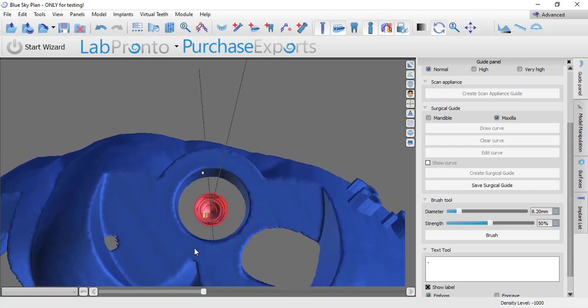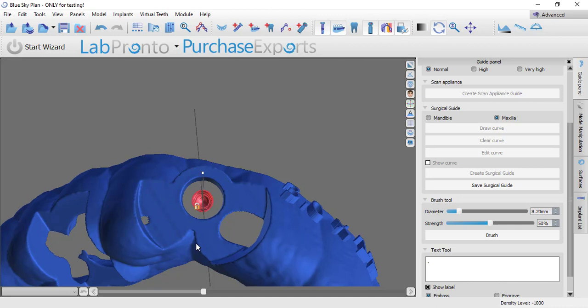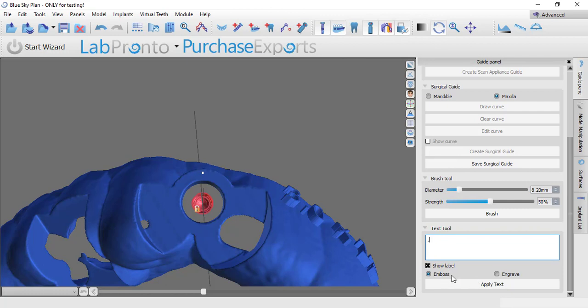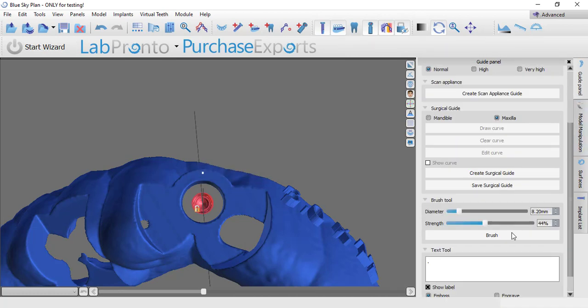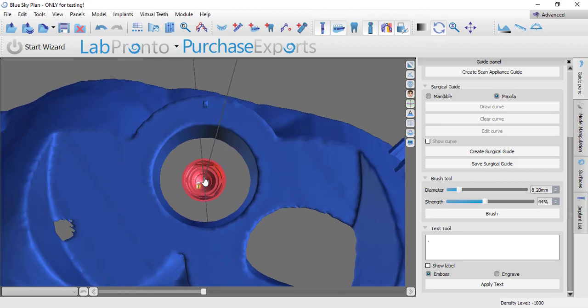I'm going to use just a period — type in a period using the text embossing tool. I'm going to orient it looking straight down the implant. The more you zoom out, the bigger the object, and we probably want it right in there. If I can rotate the implant in and guarantee the flat indicator of the driver is lined up to this little dot I've created, we should be good. I'll go ahead and emboss that into my surgical guide — let's select the right model, choose the guide with windows, and emboss it.